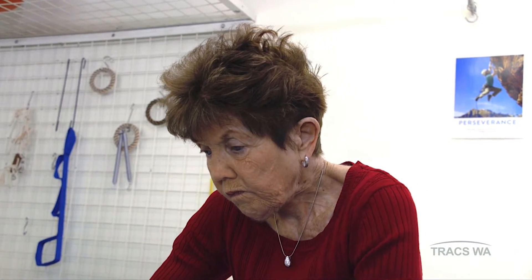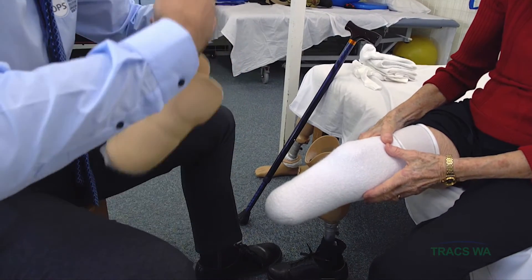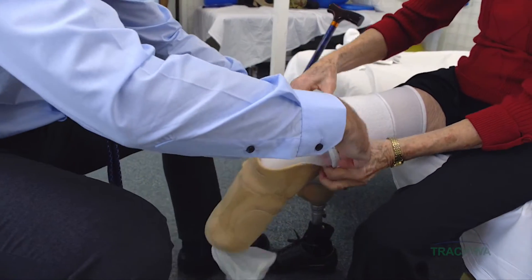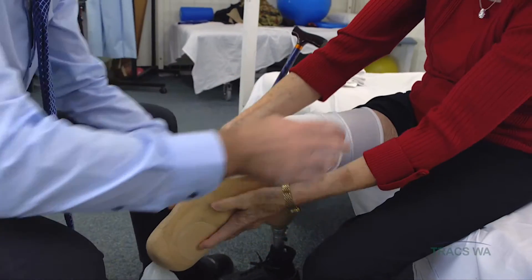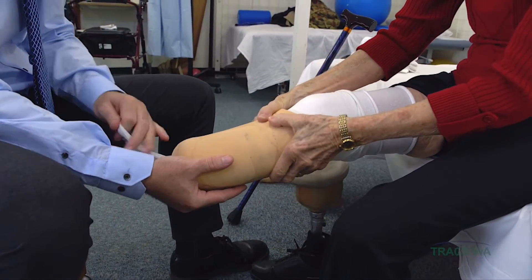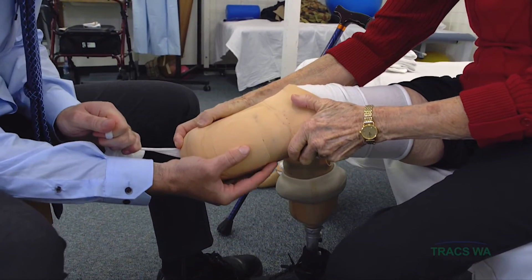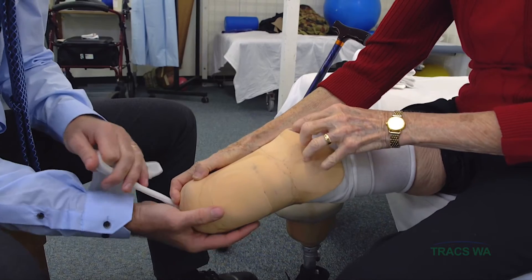So when we've got those socks on, we get the nylon pull-through sock as we've talked about. We need that just up to your knee — it doesn't need to be pulled up too hard. Then you pull the liner up and I'll provide some gentle tension. And that's still going to come up there as far as that.